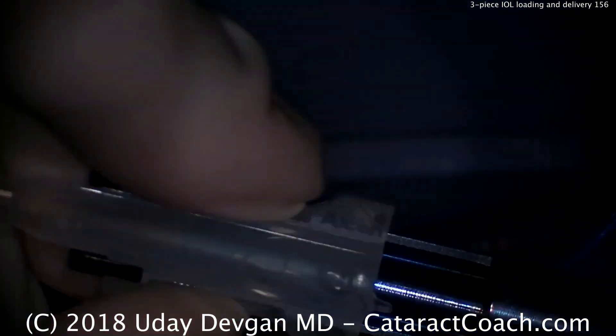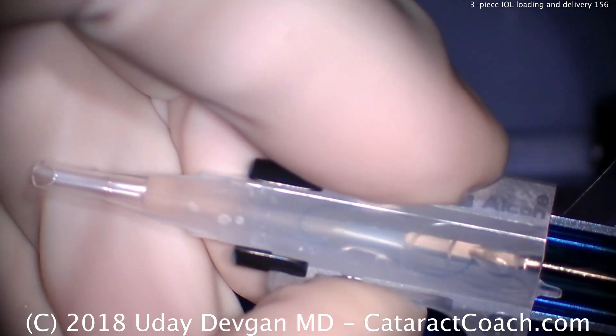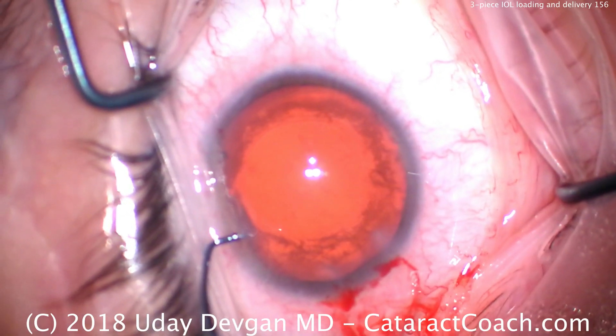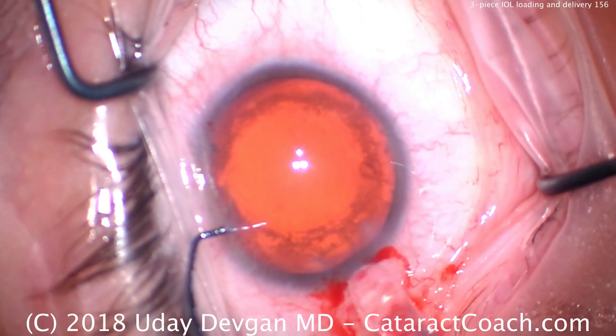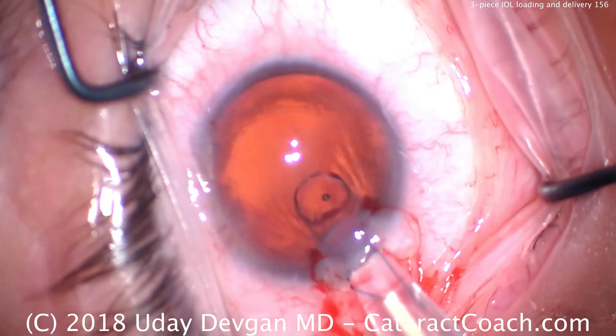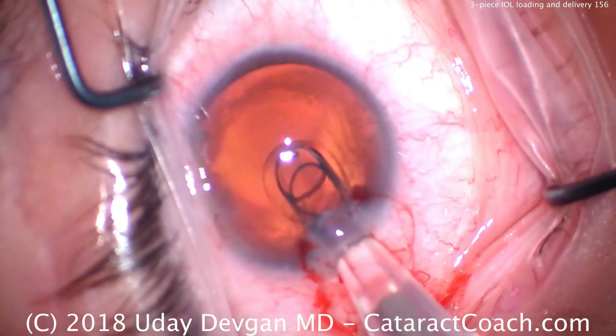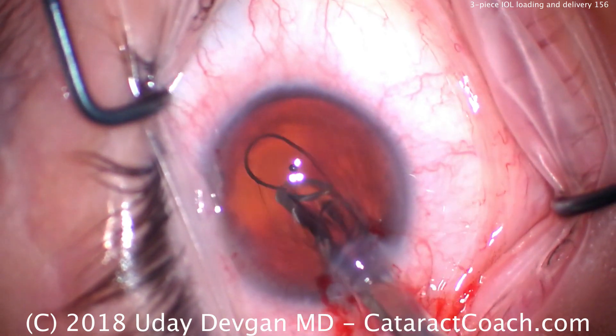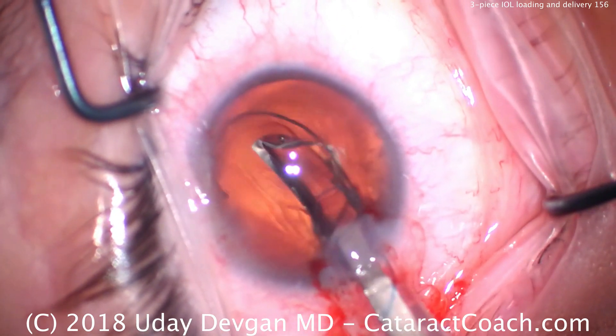That keeps the trailing haptic away from the pusher so that it goes down without being kinked. We now snap this cartridge into the injector, advance the plunger, and there it goes. Notice the haptic is correctly oriented at the very tip. Because the haptic is correctly oriented, it's going to come out in the correct orientation — anti-S. There's the leading haptic; it goes right into the capsule bag in the correct orientation.